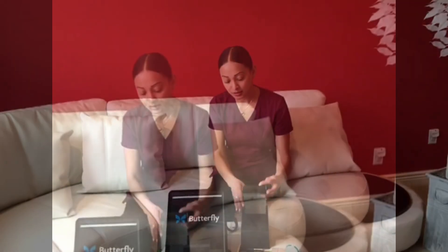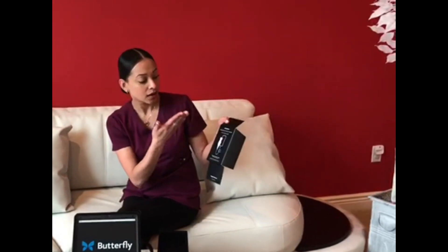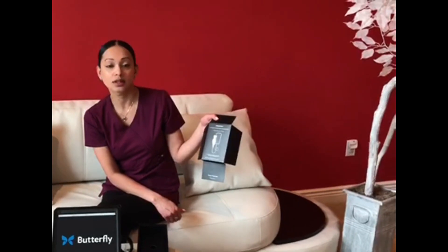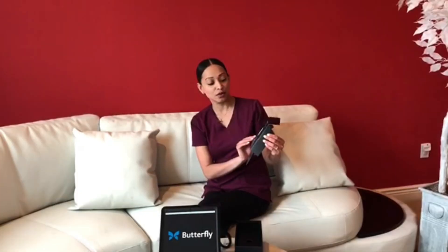So continuing with what's inside the box — this is just a little display card, a little FYI. It tells you: number one, download the app in the App Store; number two, connect to your phone; and number three, apply gel before scanning, which is very important, or your images will never look good. I also just want to mention that downloading the app is completely free and included with your purchase.